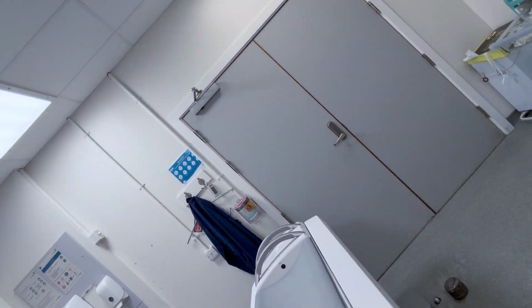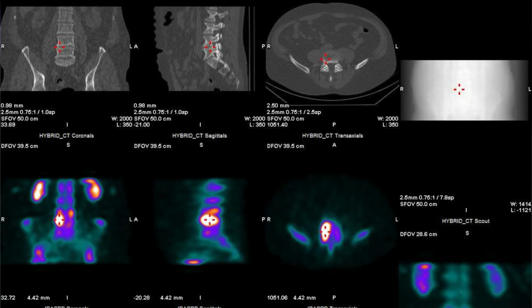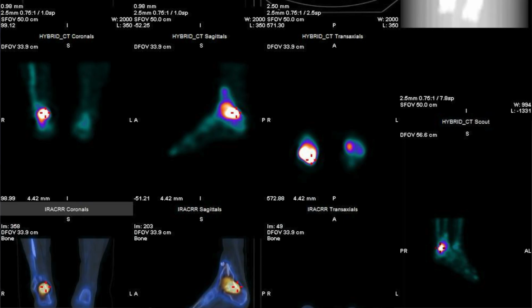These are like pictures of specific body parts to provide a better view. In some cases, static views are not enough and we need some detailed images, which is where a SPECT CT comes in. In a nutshell, a SPECT CT acquisition involves combining SPECT and CT images into one to create a 3D version. This allows us to locate and enhance images of a particular organ or region.